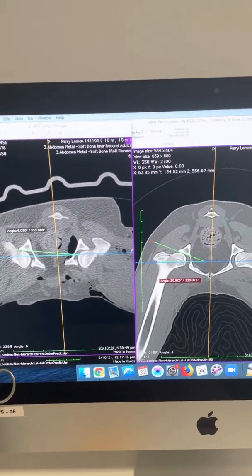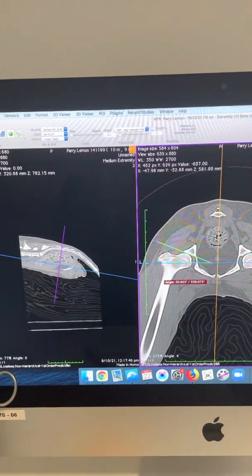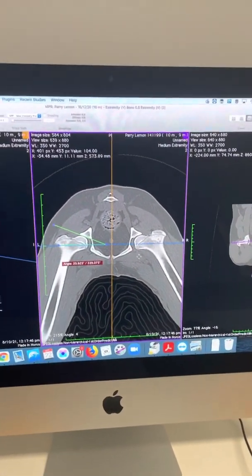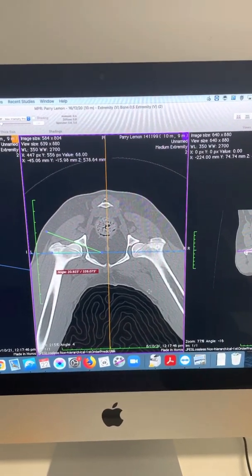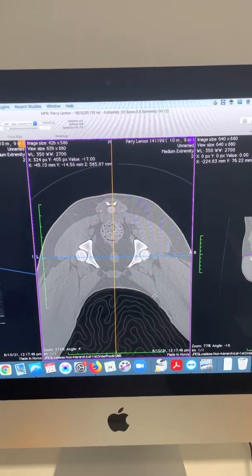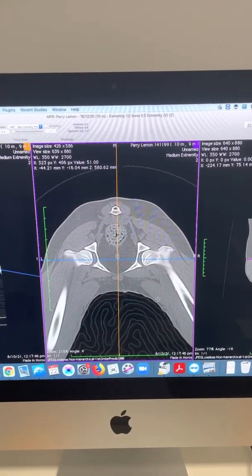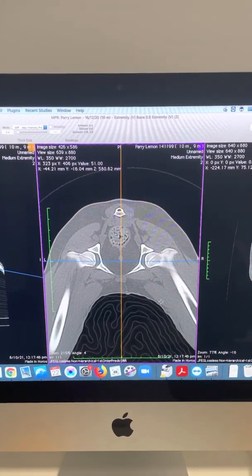One of the controversies around dogs with hip dysplasia at a young age is when they would be a good candidate for performing a DPO surgery. Our selection criteria here is pretty stringent — they have to meet a few different criteria — and a CT scan is probably the most useful test for us to establish a lot of these different things.